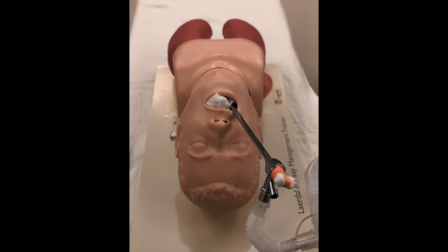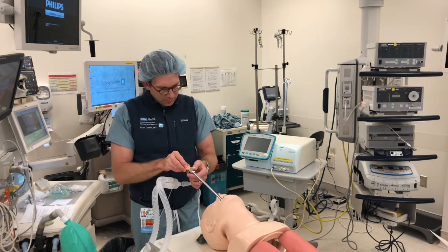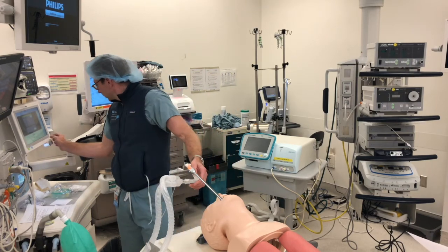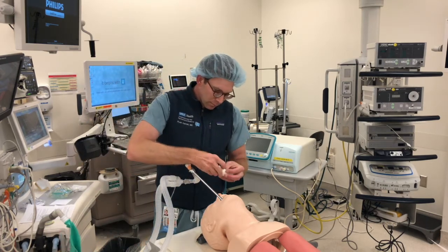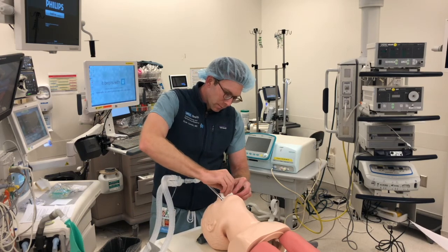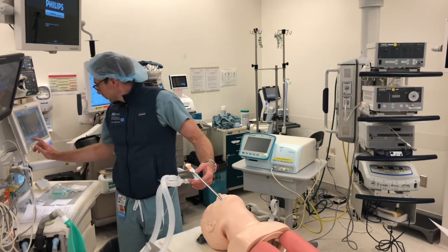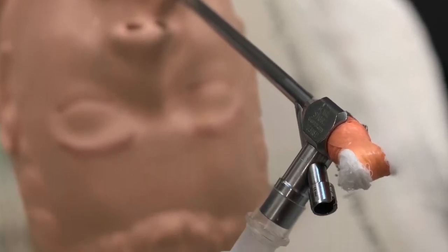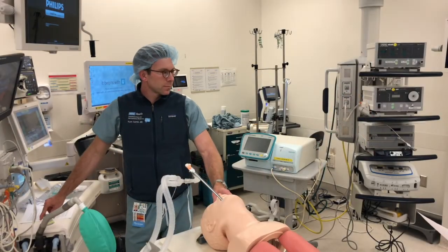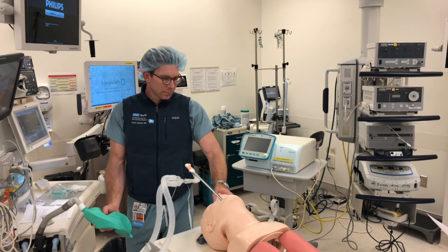So now the surgeon has decided to proceed with rigid bronchoscopy — and as you can see, the rigid bronchoscope is in. It is possible to do rigid bronchoscopy with a regular anesthesia circuit hooked up to the rigid bronchoscope via a port designed exactly for that purpose. However, it's very difficult to control ventilations under these conditions because you don't have a sealed airway — you have to seal the end and often pack sponges in the mouth, being very careful to remove them at the end. If you're going to do this, it may be easier to keep the patient spontaneously breathing under deep inhalation or IV anesthesia and assist ventilation manually.